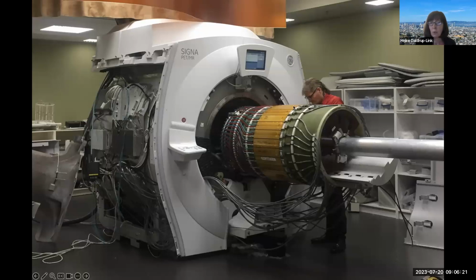And that allows for the introduction of PET detectors into the inner bore of the MRI scanner. So the ultimate inner diameter is again 60 centimeters. And so now this allows us to simultaneously acquire MRI images and PET images at the same time.